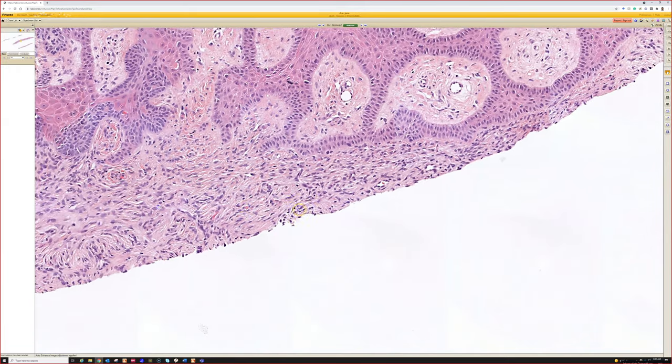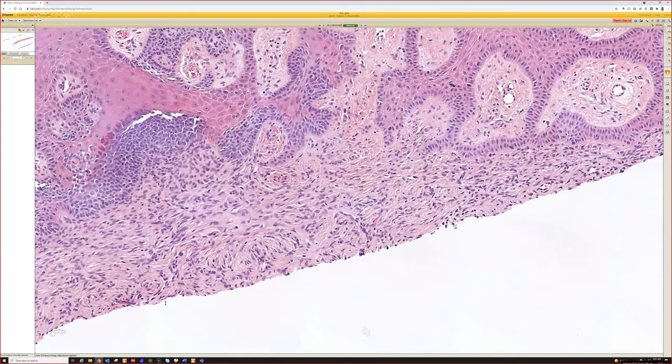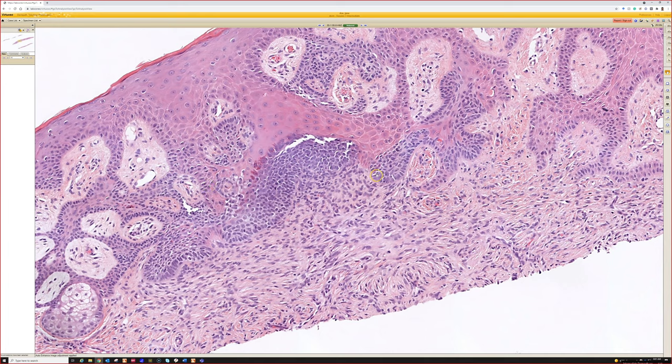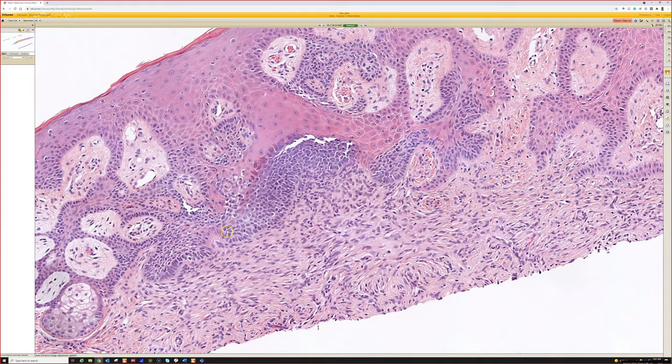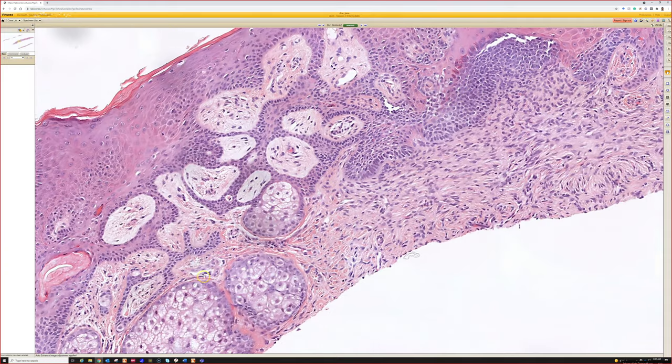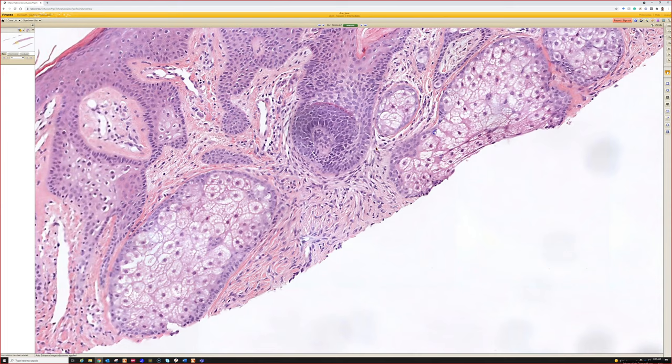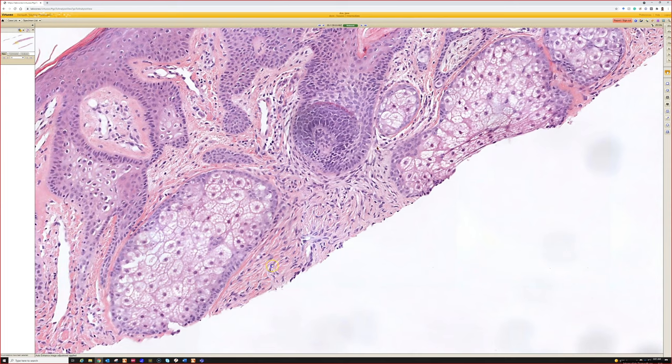This is a dermatofibroma. Sometimes dermatofibromas can induce the epidermis to grow. They either make the epidermis get acanthotic and hyperpigmented, or they can cause little hair follicles to grow that mimic basal cell carcinoma, or they can cause sebaceous glands to grow.